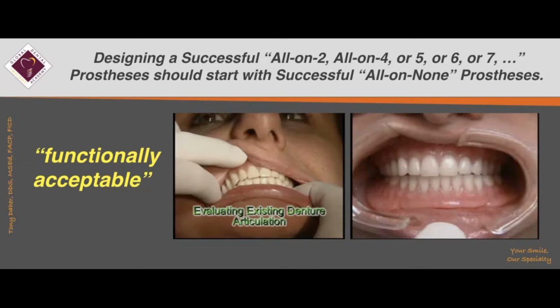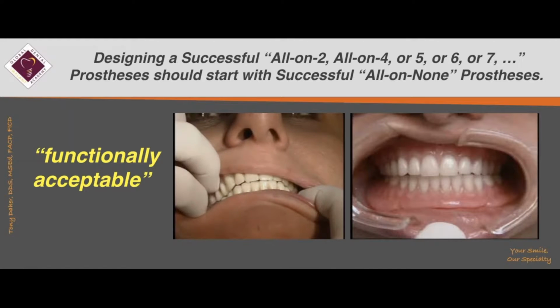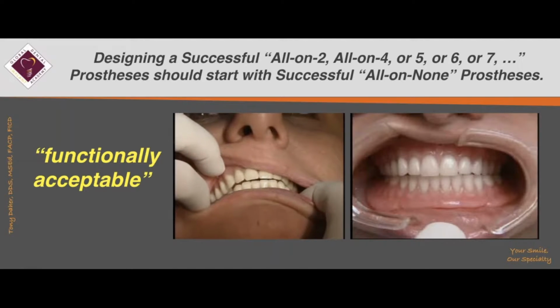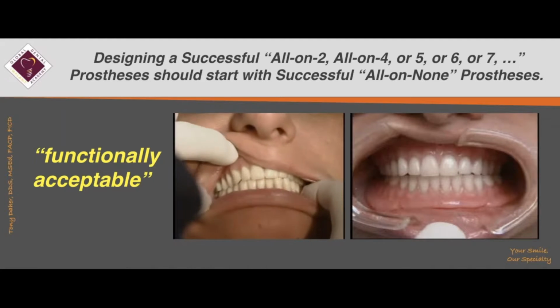Go ahead, move forward. Move forward. A bit more. And put your chin down. Chin down. Okay. Now, go ahead, move forward.